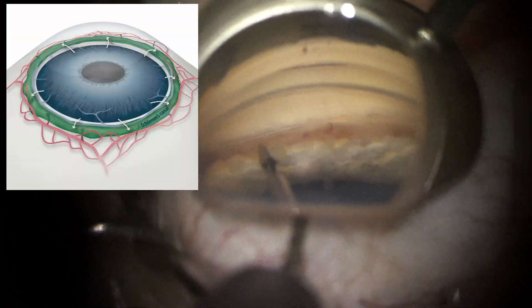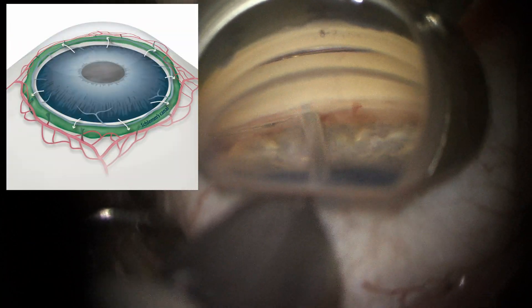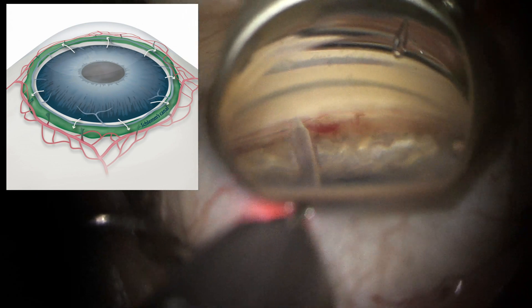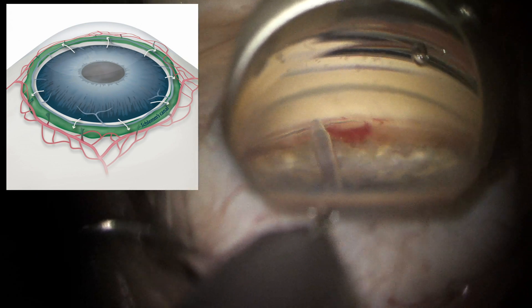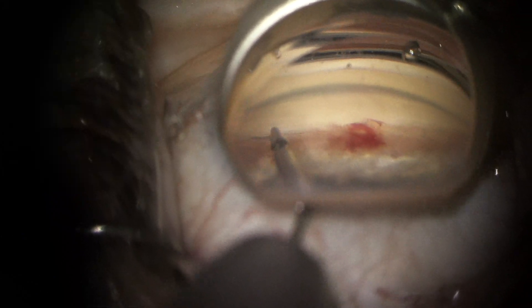Through the goniotomy, we place a catheter. This particular device has an LED light at the tip, which shows the catheter as it runs along the entire course of Schlemm's canal. This is, of course, sped up a little bit. You can see the red blinking tip as we reach the end of our 360-degree course.